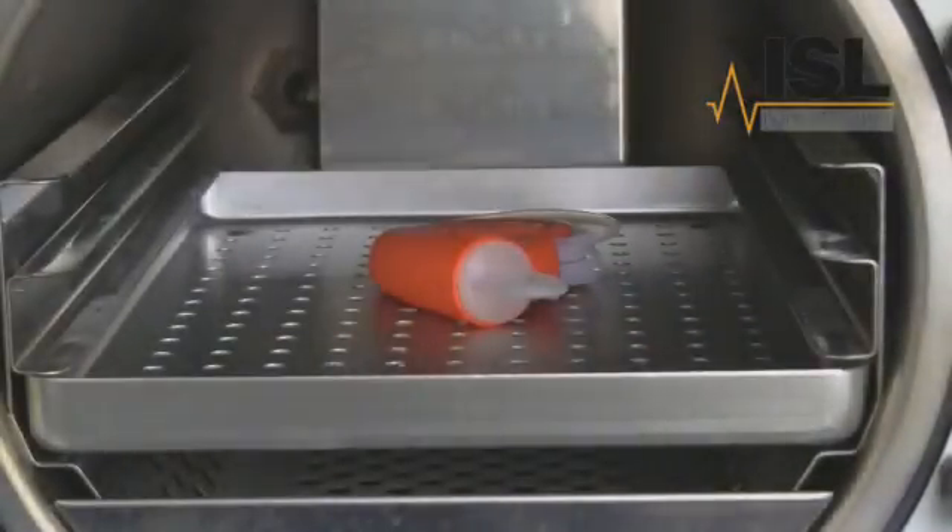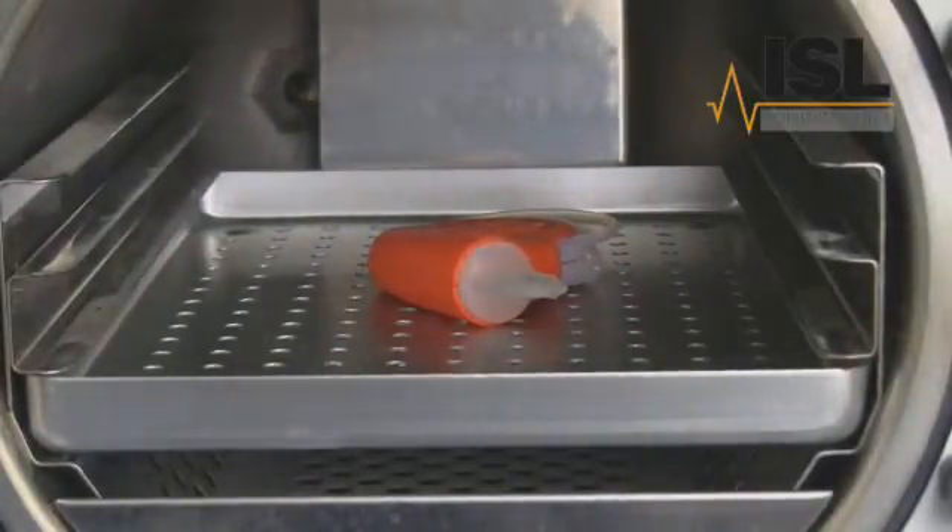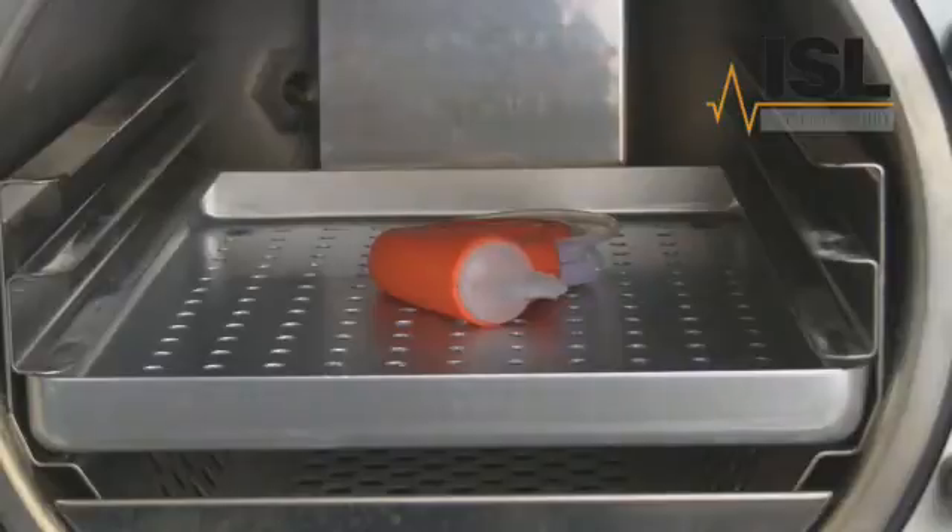The test should be performed with only the furniture and the helix present. No instruments should be processed in the chamber at the same time. If you also perform a daily automatic control test, you may want to save time by performing both these tests together. Once the helix is in place, close the door and start the cycle.